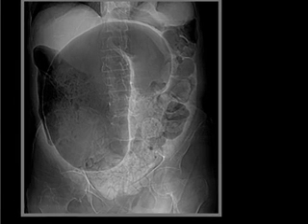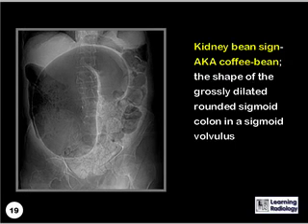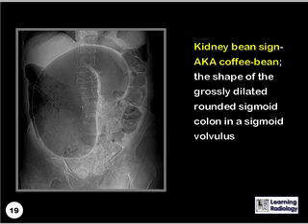What is the name of this sign? This is the kidney bean sign, also known as the coffee bean sign, which is the shape of the grossly dilated, rounded sigmoid colon in a sigmoid volvulus.